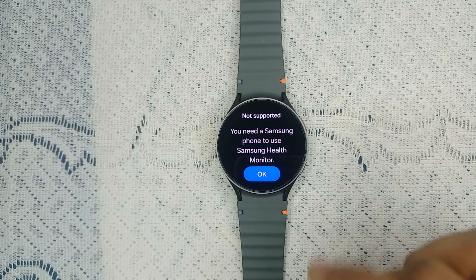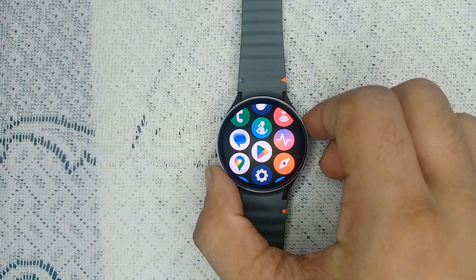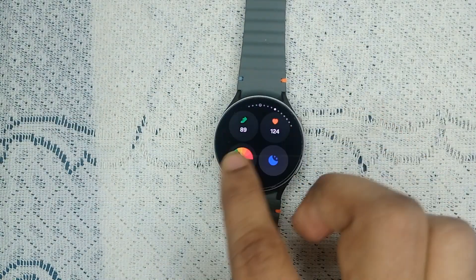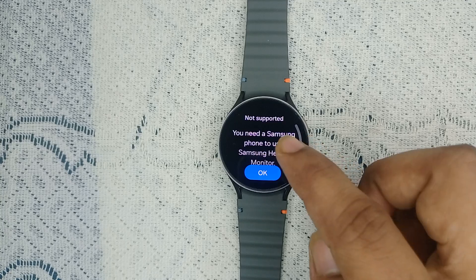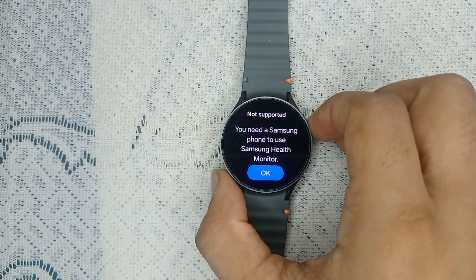Also, when you go to ECG mode — swipe right until you find ECG — and tap on 'Learn More', you will see a message that you need a Samsung phone to use Samsung Health Monitor. So be sure that you have a Samsung phone with the latest version, because previous versions do not support the ECG and Samsung Health Monitor feature.